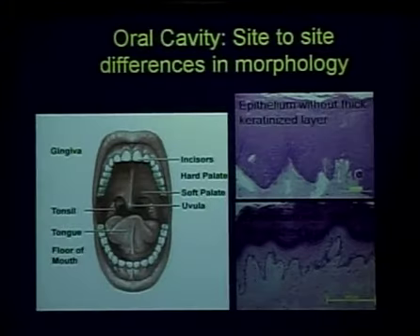And then once we know what those optical properties are, we can do Monte Carlo simulations of light propagation in tissue using the information about the optical properties that we've measured from our oral cavity specimens to understand where the light is coming from and what's responsible for this drop in fluorescence.